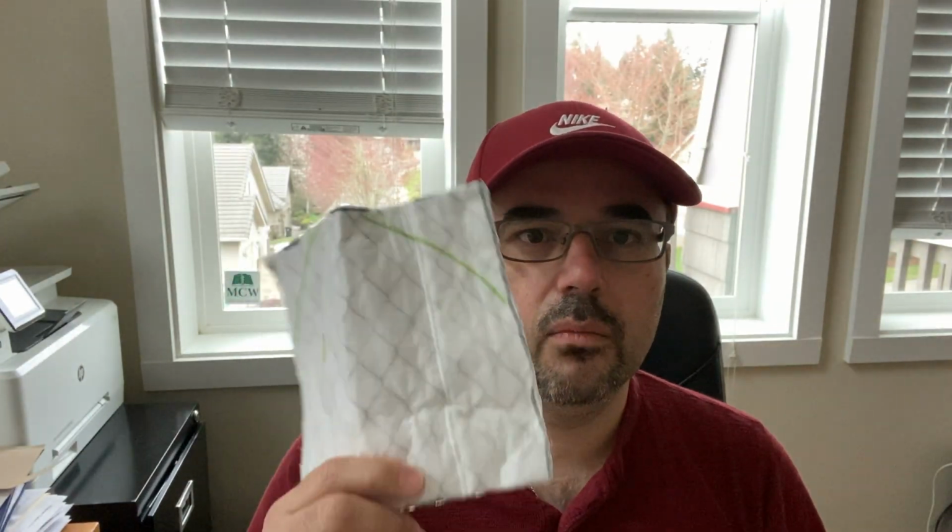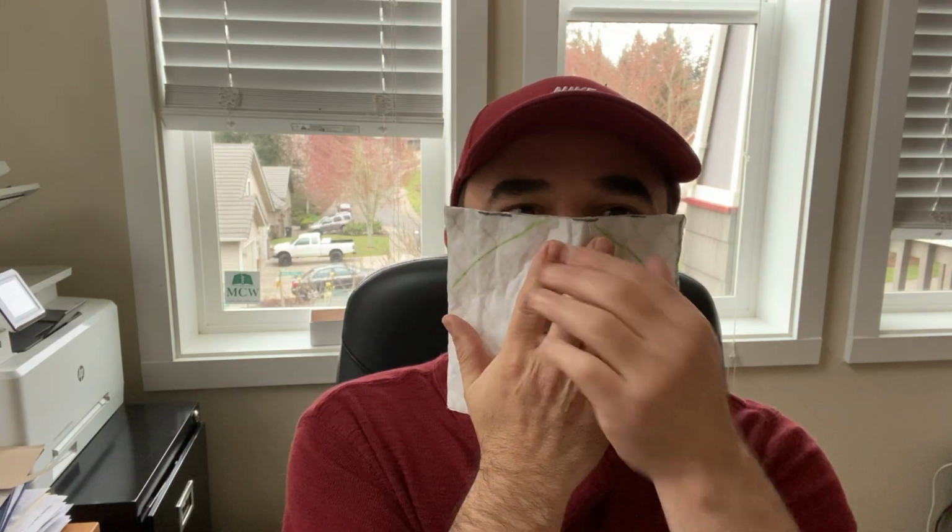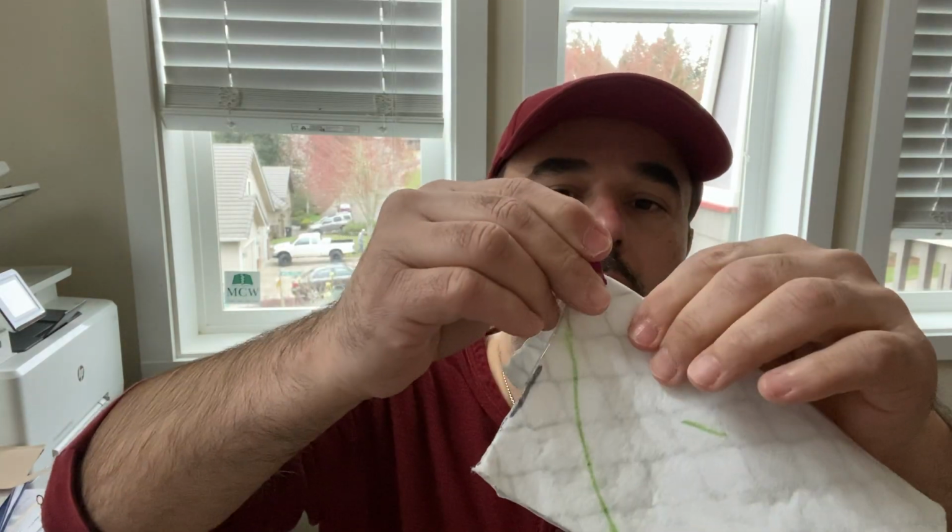Okay, step 2, once you've put your glue along the filter, is to start measuring it on your face. If you wear glasses, I recommend that you remove them for this part. So lay your filter up on top of the bridge of your nose. This should be kind of flat against your nose, and then pinch the top, and you want it to lay perfectly on your nose so that it's not going to move, okay? And so then you'll want to pinch that. And then the next thing you do is you'll get one of those small clips, and you'll put that on there. And then again, dry fit it again, and make sure that it's fitting high up on your nose, because you don't want it to move.